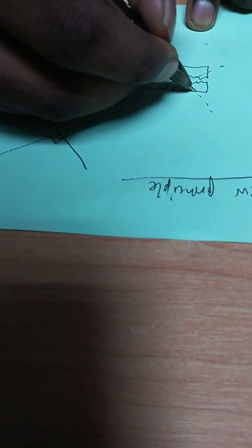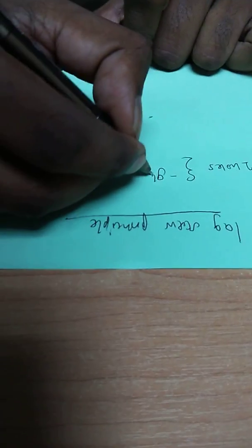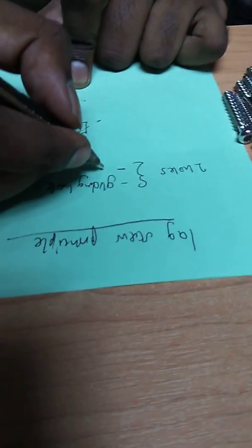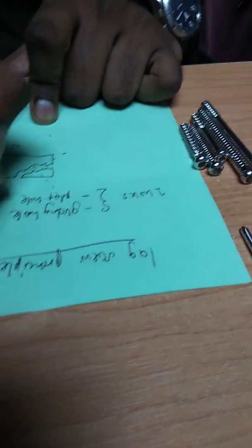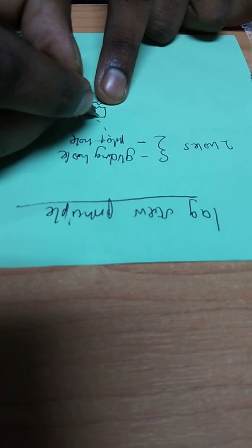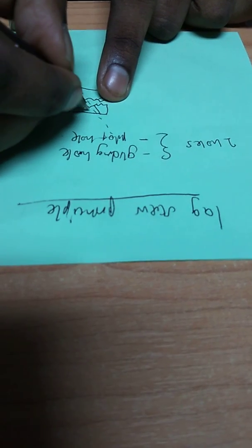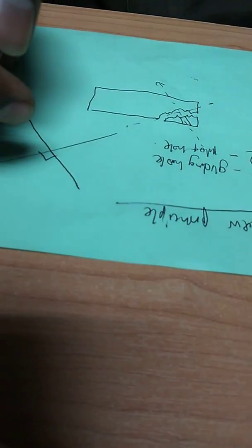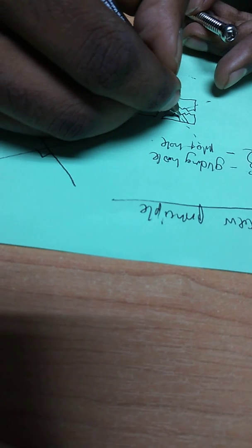Basically, there are two holes that you need to drill, which is the gliding hole at the near cortex and the pilot hole at the far cortex. So first you drill the gliding hole perpendicular to the fracture site. The gliding hole has to be the same diameter as the screw that you're going to use. Okay? So you drill this.